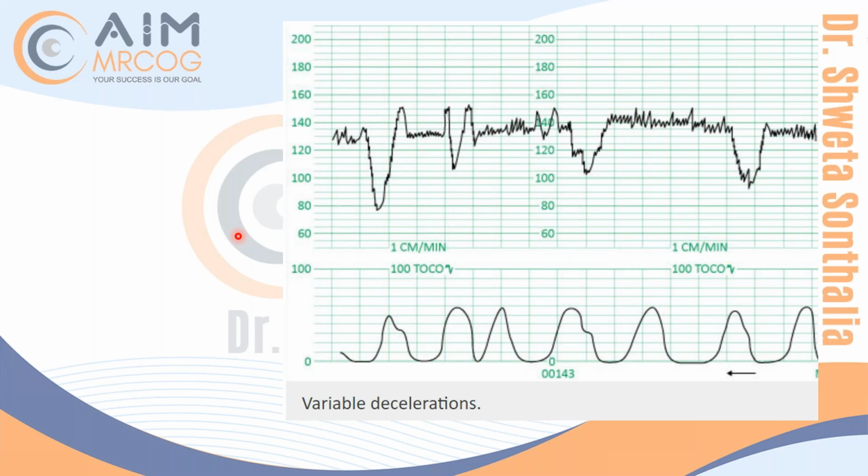What I'm trying to inculcate in your brain is that it's looking variable, isn't it? Is it looking similar? No, the shape is different enough. It's looking variable. So sometimes when you get stuck like this, where you're not able to differentiate, you will see that variable always looks variable. If you see, this is deep, this is shallow, this is wide, all shapes and sizes are different.